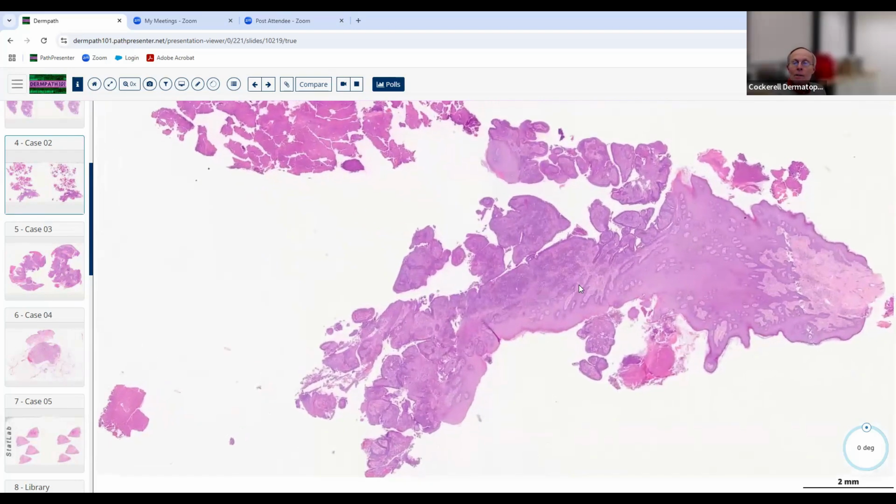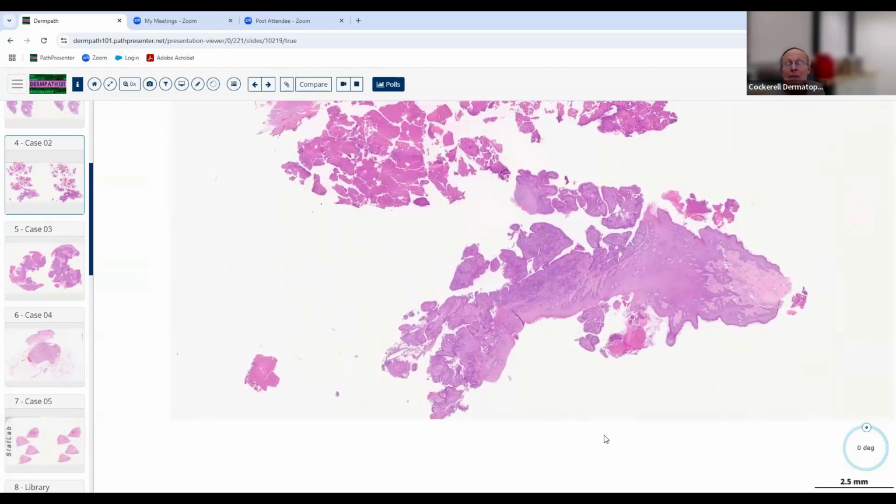Let's go to higher magnification, and you've got a shave of it. So unfortunately, we don't have, like we did before, where they shaved off the entire lesion. So we can't really apply breadth, symmetry, and circumscription as easily in a lesion like this. We're going to have to use other criteria to tell us whether it's benign or malignant. But at least when we look at it, it seems like over here, it kind of comes to a stop at this edge. We don't know about over here.